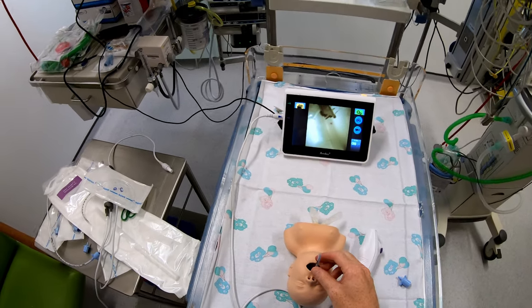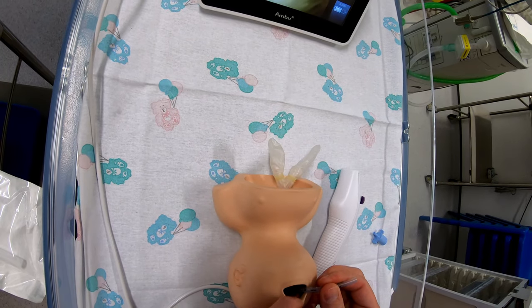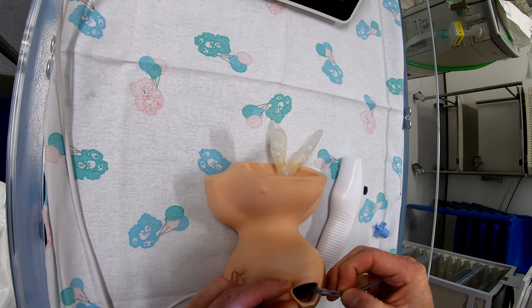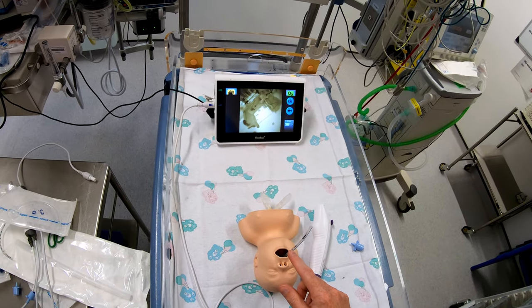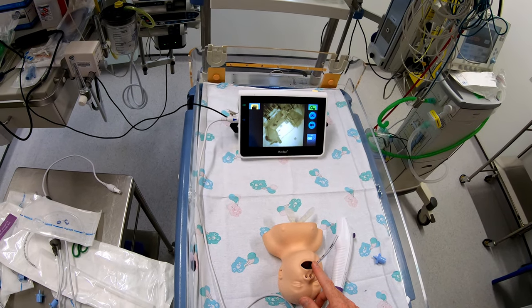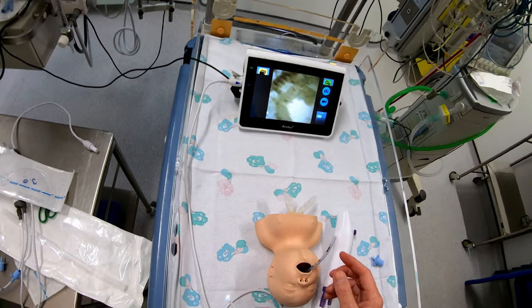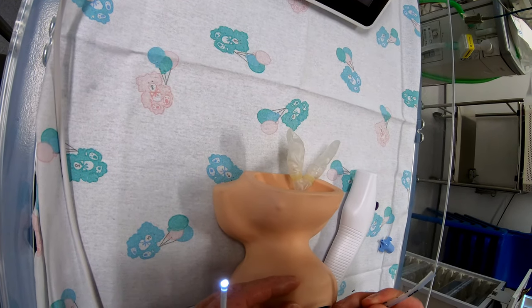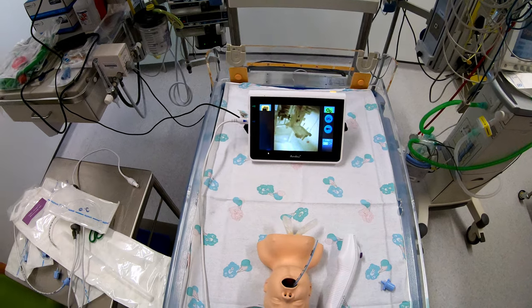This may be more of a problem for a nasal intubation. The tube is in at about 13 centimetres, which is actually going to be too far in for a patient of this size — for a three kilo baby, nine centimetres at the lips would be fine. So let's pull it back to nine centimetres. One of the problems with these models is they're just not anatomically correct.